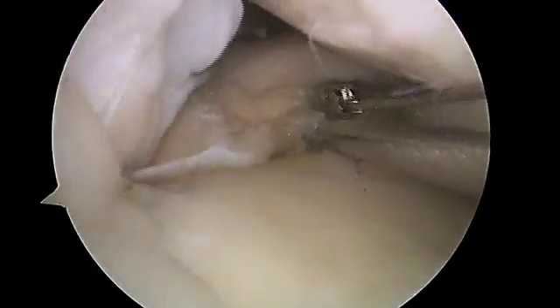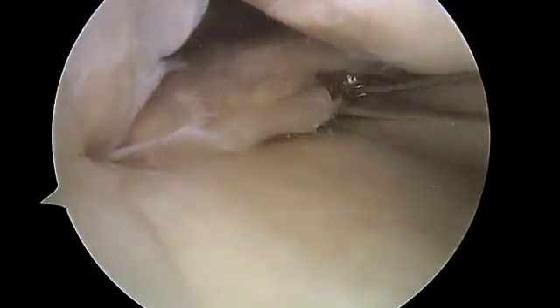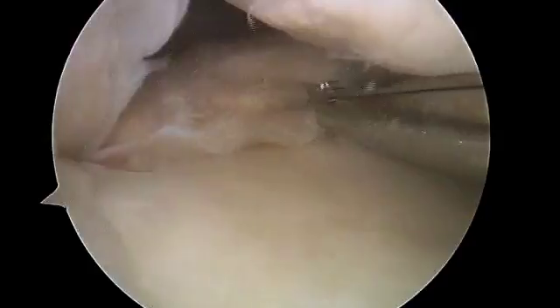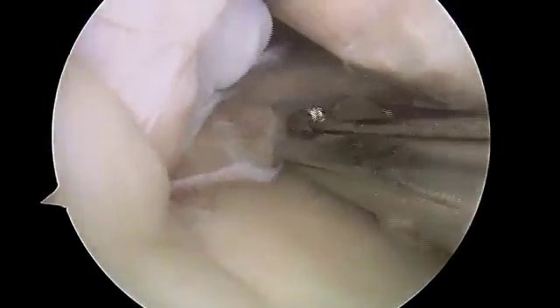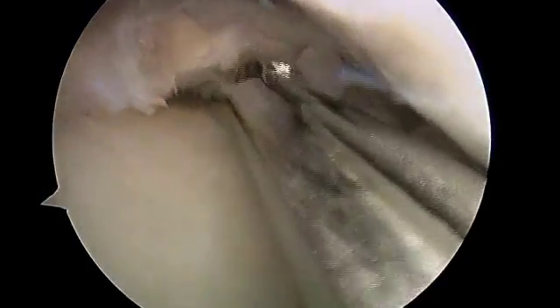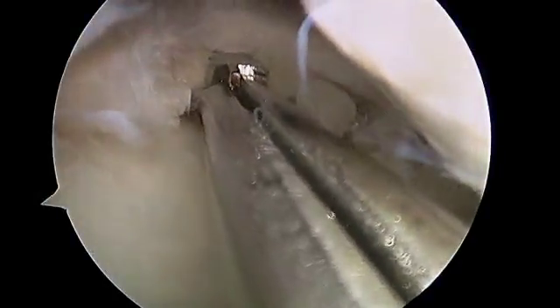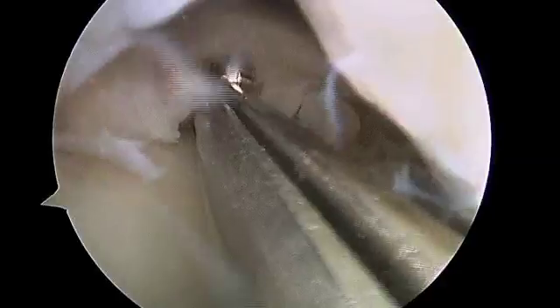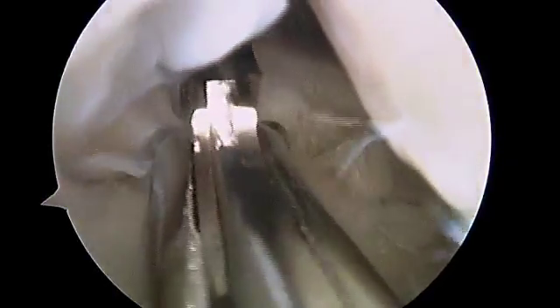You can see there's what we call a longitudinal split where there's a superior leaf and an inferior leaf. We're going to take out the inferior leaf and preserve the top part of the meniscus as a method of stabilizing this. To reorient you, the femoral condyle is above and the tibial plateau is below. With the meniscal punch, we're going to take out just as much of that inferior leaf as we need to stabilize that meniscus.